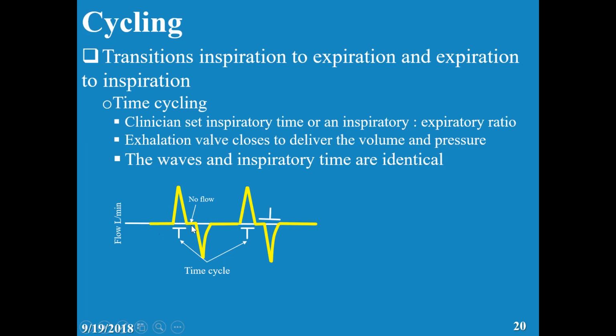So there is a little bit of pause, but it should not be a prolonged pause when there is no flow between inspiration and expiration. Is that clear? Because the baby breathes in, the valve is closing, the baby wants to breathe out, the valve is not allowing it, so there is a pause. This pause is very important.